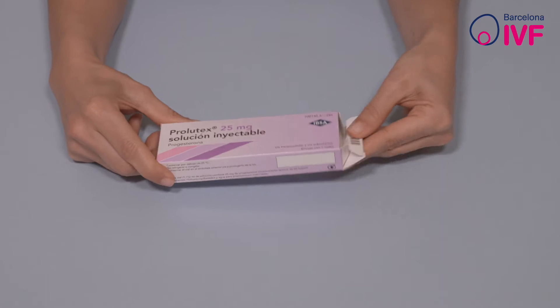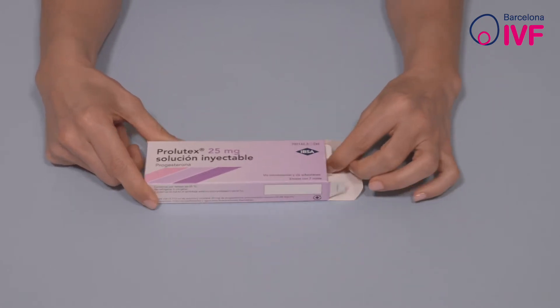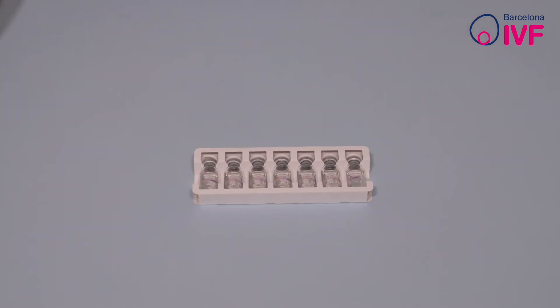Open the box of the medication and place its content on the table. You will see that the kit consists of 7 vials of medication that have already been prepared.